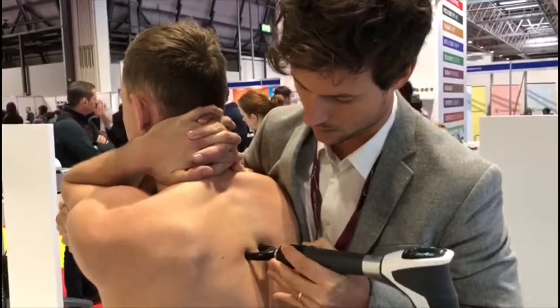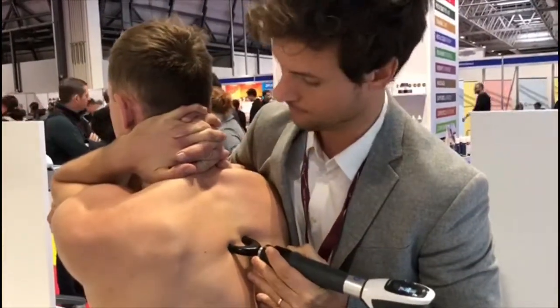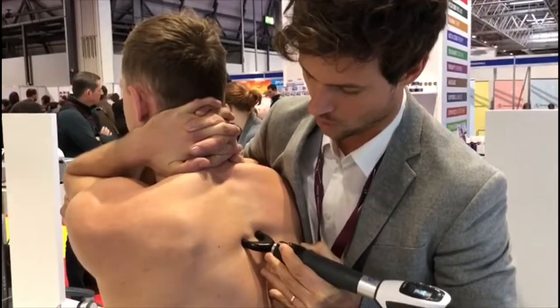Then we'll try. There is a joint there as well. Still comfortable? Yeah. All right. So we'll change to a flexed position.